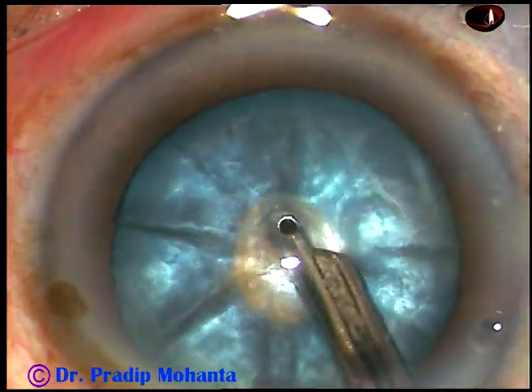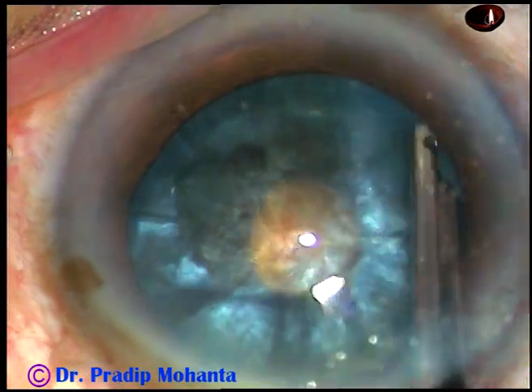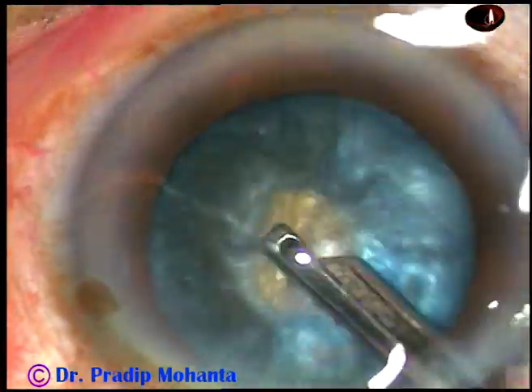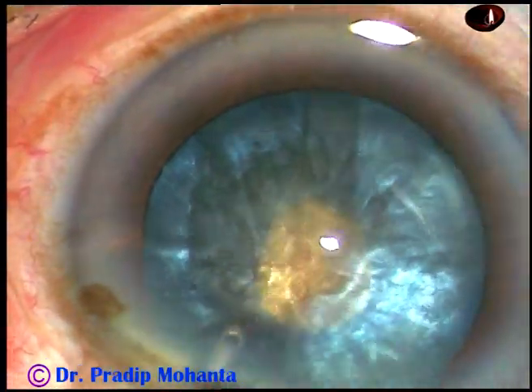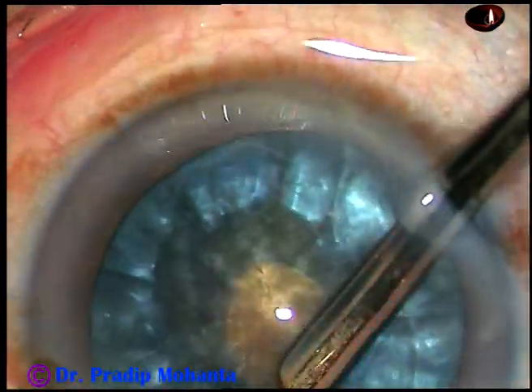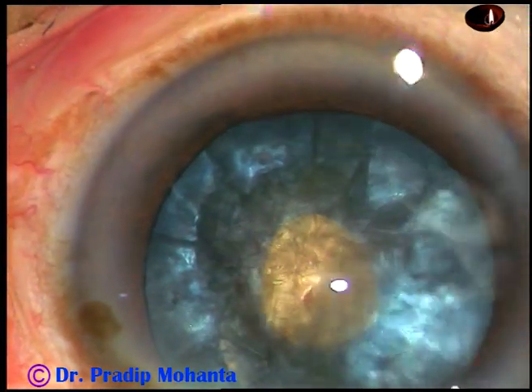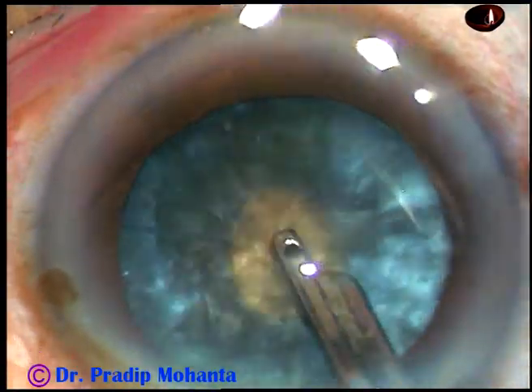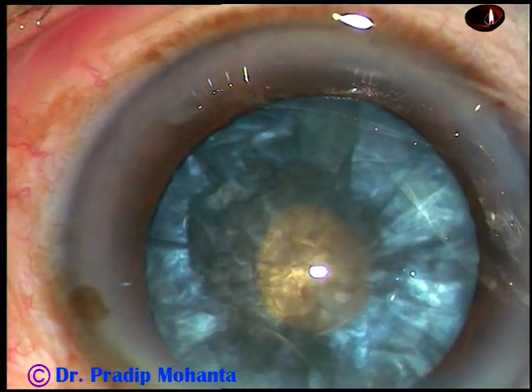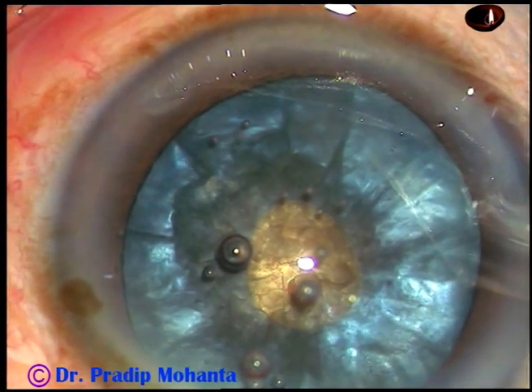Now, with the help of a Simcoe cannula, or just by irrigation-aspiration of bimanual IA, or only by irrigation, we can remove some cortical matter and decrease the intralenticular pressure. In this case, the sub-incisional cortex could not be removed by Simcoe. However, the intralenticular pressure has decreased significantly and I shall be able to do the rhexis without any problem.